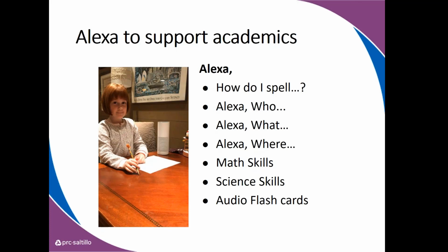If you have little ones at home, we're doing homework. Alexa, how do I spell? She'll spell for you. Alexa, who starred in The Godfather? You can do silly things like, Alexa, what's your favorite color? Or Alexa, where is Alaska? Or Alexa, what's 22 times 563? So whether it's math skills, science skills, English skills, you can even create kind of audio flashcards to work through ideas as well using Alexa.